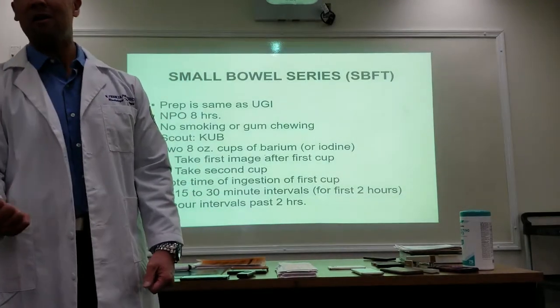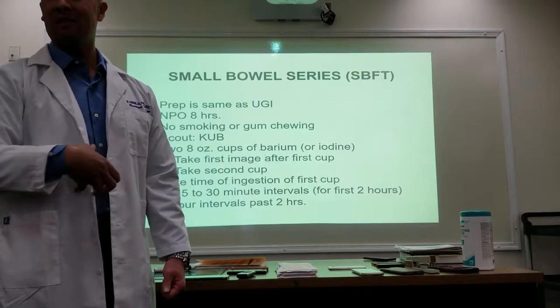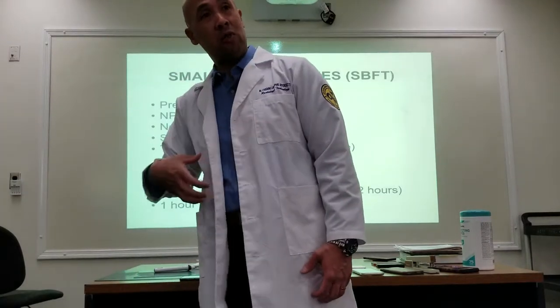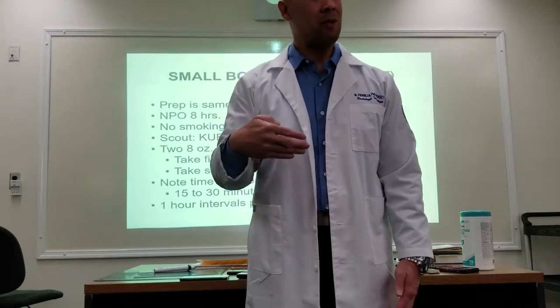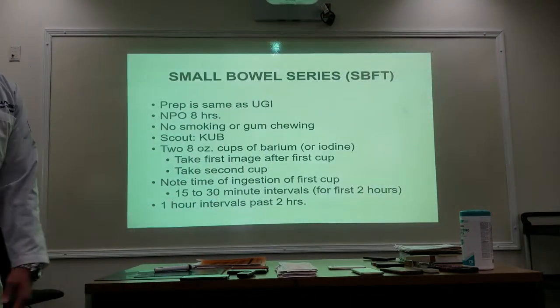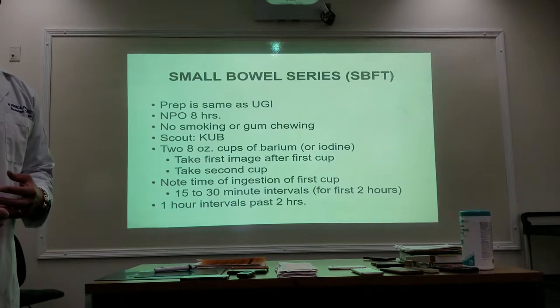RPO position. Why RPO? Isn't that the direction the stomach empties? Yeah, the pylorus goes this way. So we put them in RPO, it starts to drain this way. So we're going to put them RPO, and we're also going to tilt the table up a little bit, but not so high that they slide off the table. Okay, but high enough that gravity is going to take place to move that contrast around.